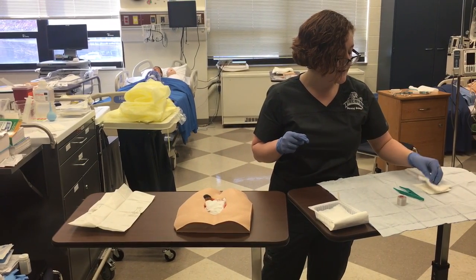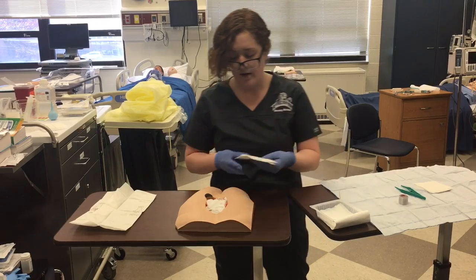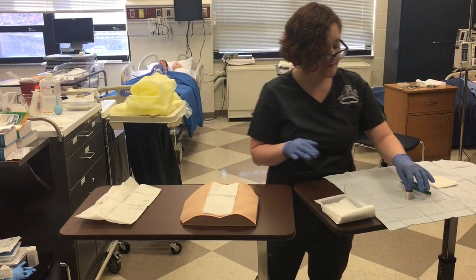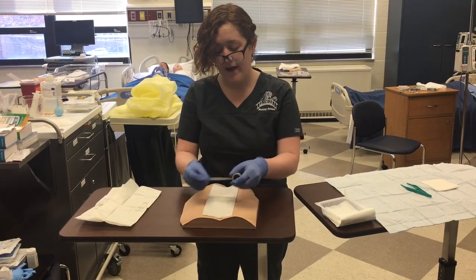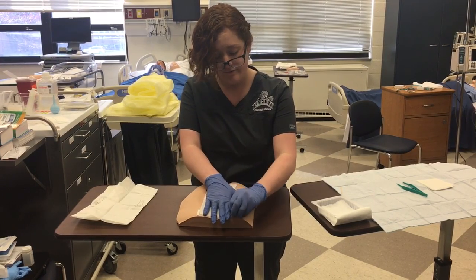Then I'm going to take my sterile wound dressing, and I'm going to apply it over the top, making sure that it is the right size for the wound. You want to make sure it's not too large or too small. And then I'm going to fasten it in a windowpane fashion.